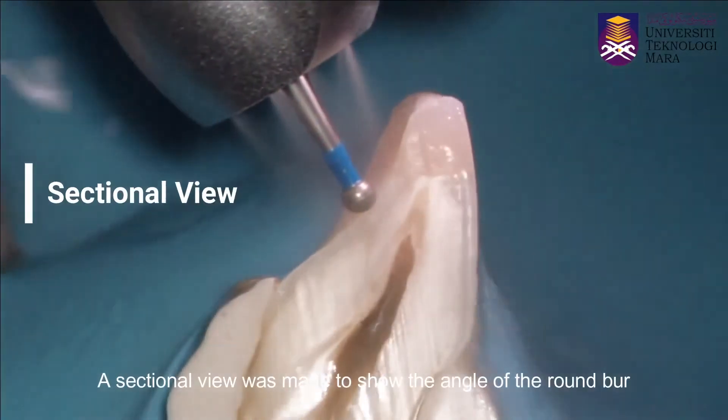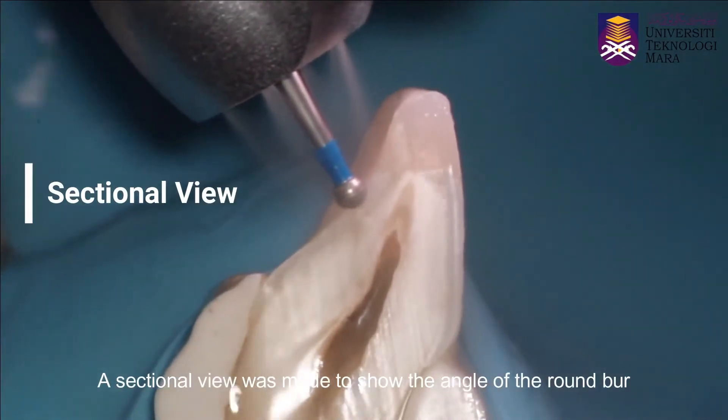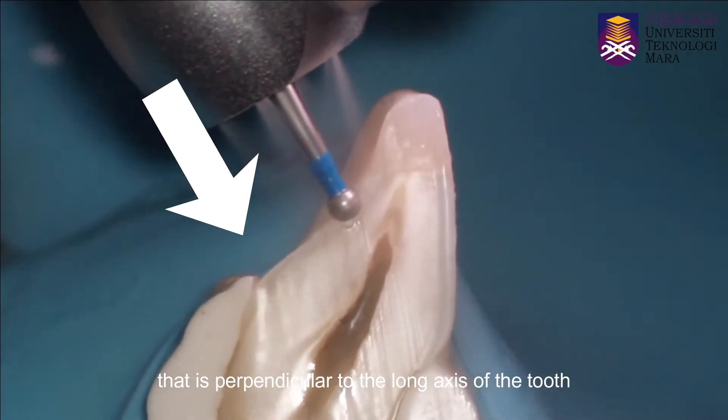A sectional view was made to show the angle of the round burr that is perpendicular to the long axis of the tooth.